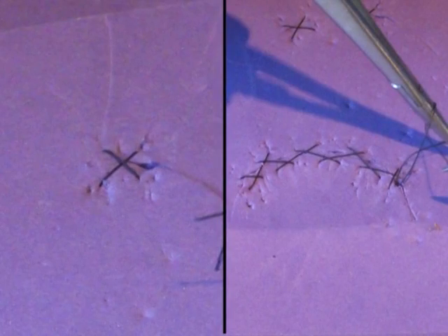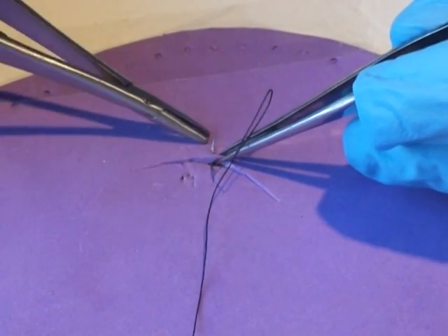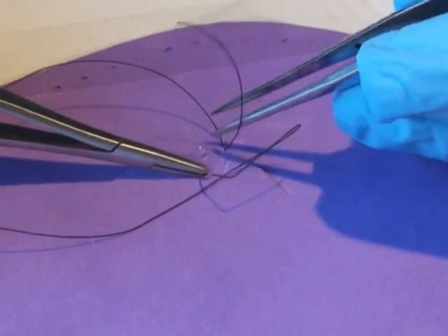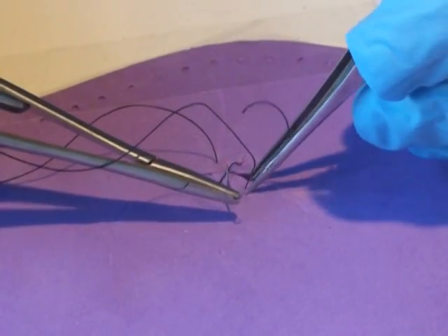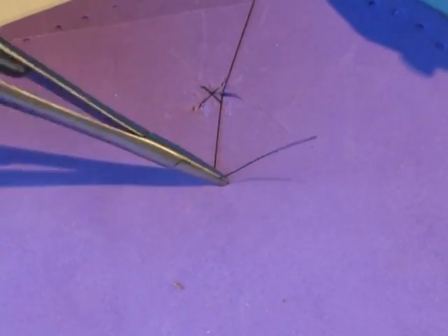Finally, here are two very useful ways of suturing incisions into the eye. The cross, or X-stitch, is one. This starts inside the wound. Then a further stitch is placed on the right, starting and finishing outside the wound. Then it is brought back to finish again inside the wound. When the stitch is tied, there will be secure closure, and the knot will automatically be buried.